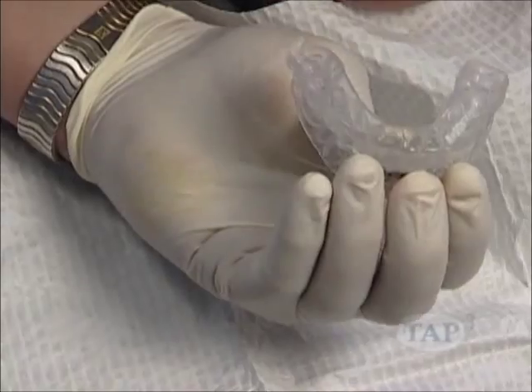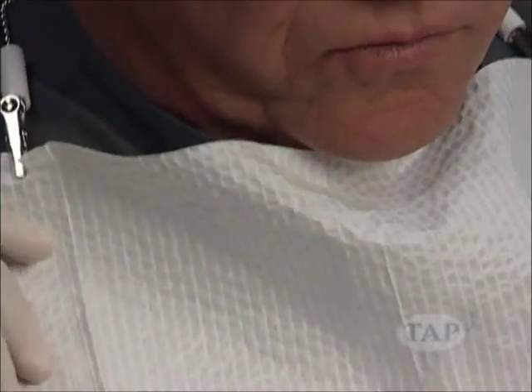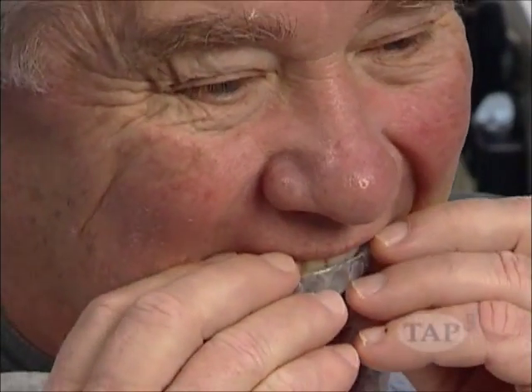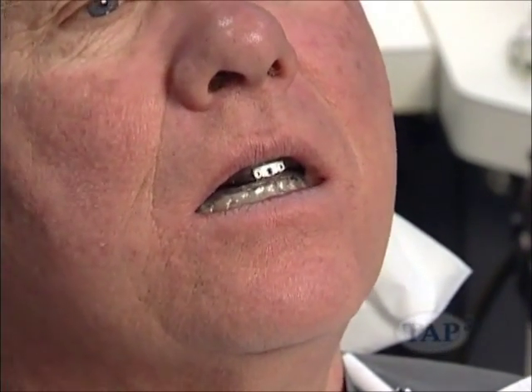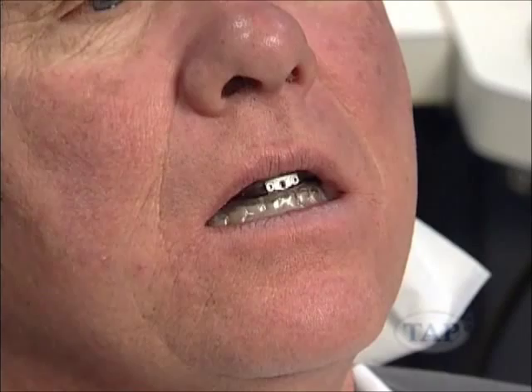Have the patient place the trays in their mouth. Make sure the acrylic is smooth to the tongue and the trays fit together properly.